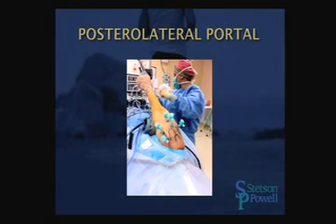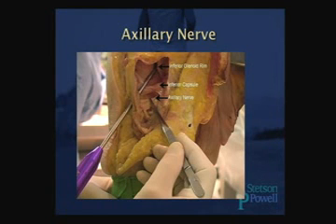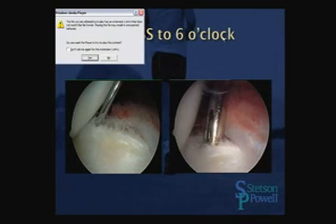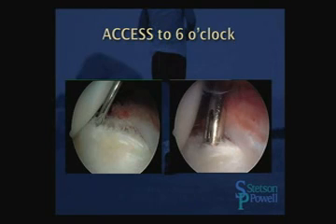This one, which you see, is just straight lateral. Depending on the version of the glenoid, it allows you to get down to the 6 o'clock position. So those are safe portals. They've been well described. This is from Keith Nord's work with dissection showing the location of the axillary nerve. Basically, there's a localization with the spinal needle. You're coming in at a 6 o'clock position and at a 45-degree angle, and that's going to allow you to put in an anchor. Can I have that video?